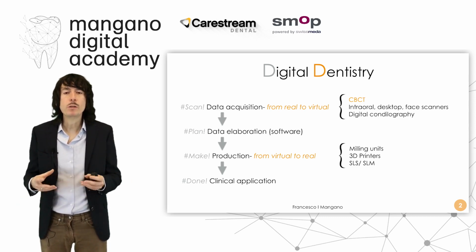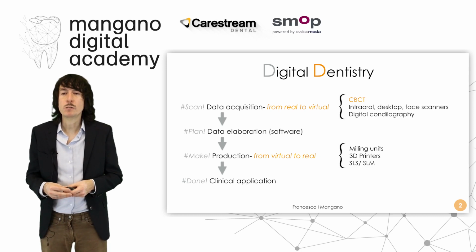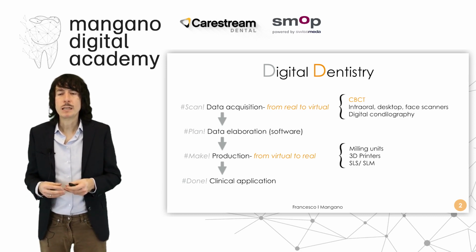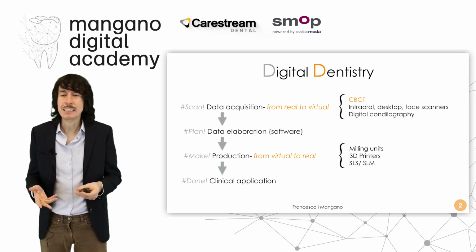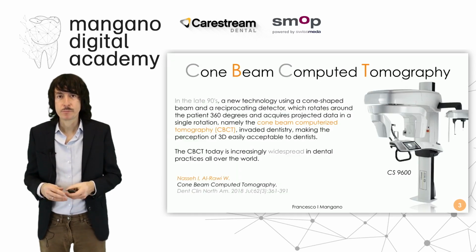Then when we have modeled these devices, we need to physically make them through different machines like a milling unit or a 3D printer, and after that we can apply these devices clinically for the last, fourth phase, the clinical application.